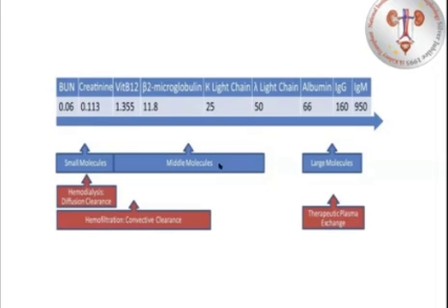And as we see, the middle molecules can be removed with high flux hemodialyzer with a good sieving coefficient, but yet they have limitations regarding the molecular weights. They can permit up to 50 something kilodalton, but bigger molecules like albumin, IgG, and IgM can only be removed by therapeutic plasma exchange, where the pores of the filters are much wider.